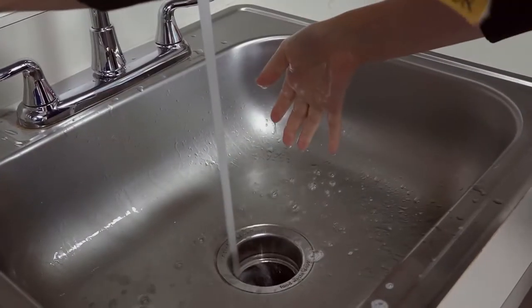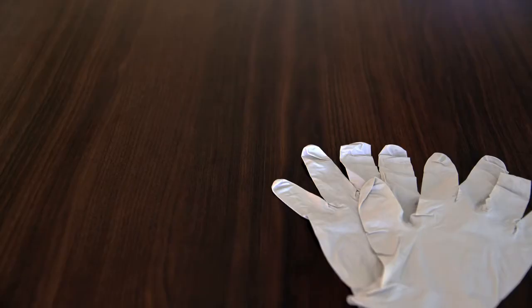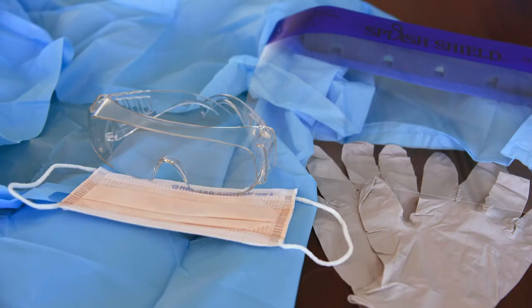Before entering the examination room to collect the specimen, start by thoroughly washing your hands. Then don PPE based on appropriate clinical and safety guidelines as well as the condition of the patient.